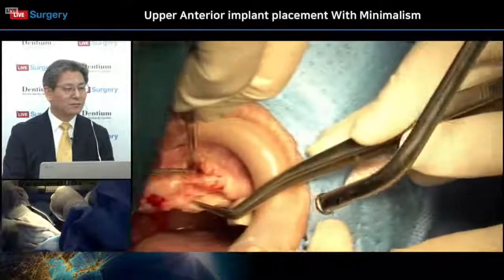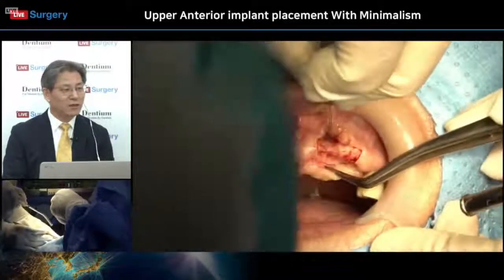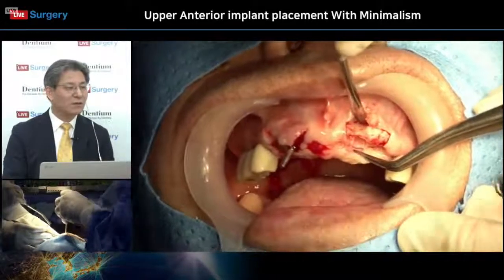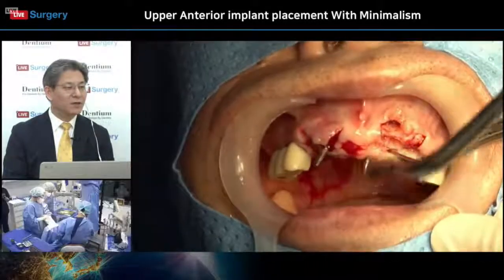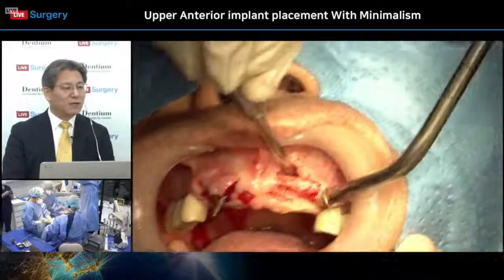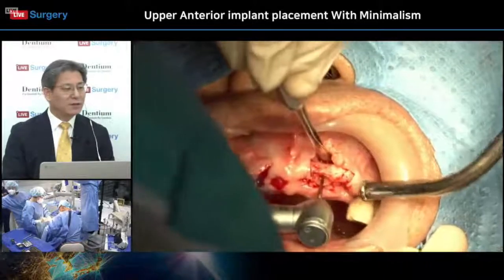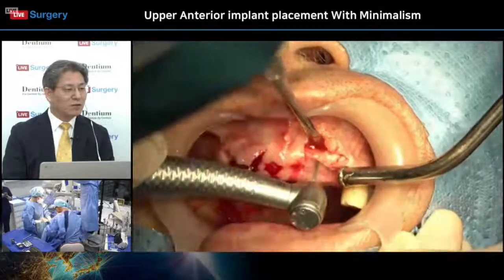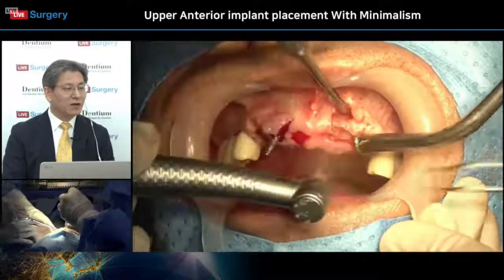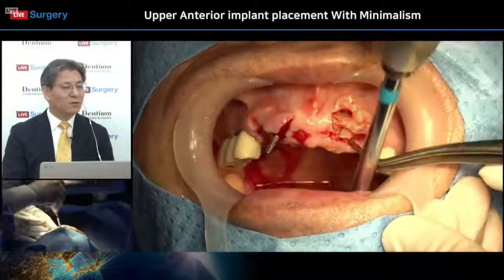But there is some concavity. Concavities are around the lateral apex area. So we're targeting this lateral incisor area. So also using a high-speed pear fissure bur for making the starting point.